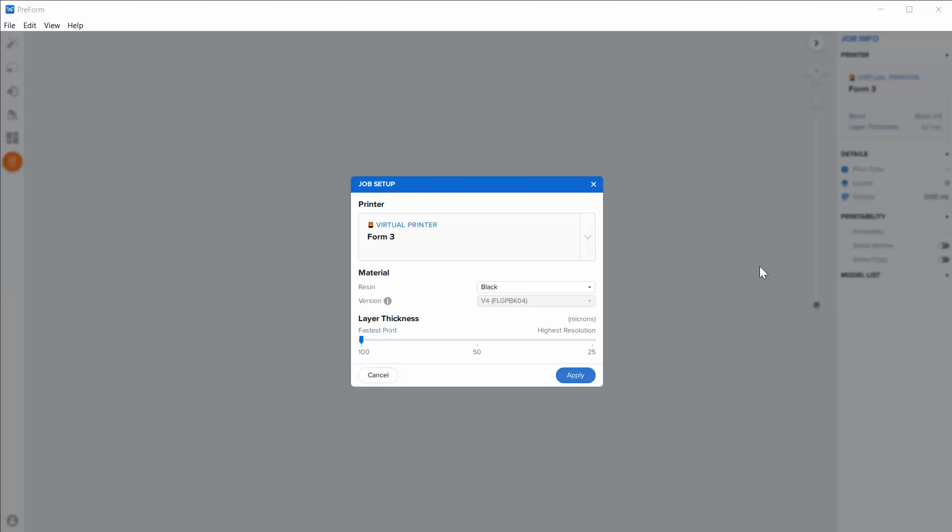Someone submitted a question asking how to set up models for 3D printing using the PreForm software. A lot of my videos focus on the RayWare software put out by SprintRay, because that's the printers I usually use, but I do also have the Form 2, so I'm going to make a video of their software. I'm using my laptop at home and it's not connected, so I'm using a virtual Form 3 printer and I'll show you the overall workflow.